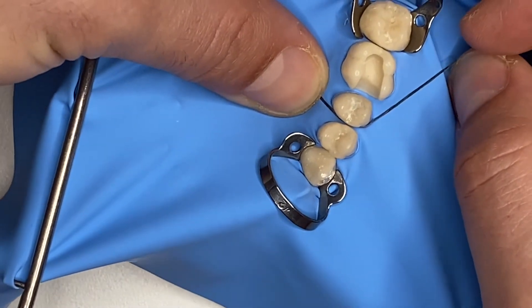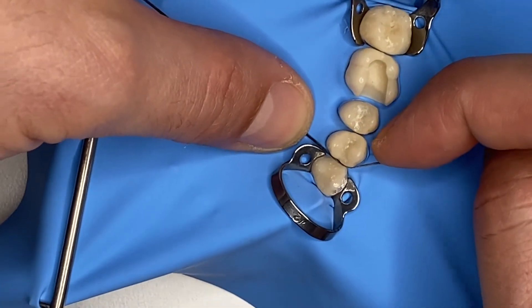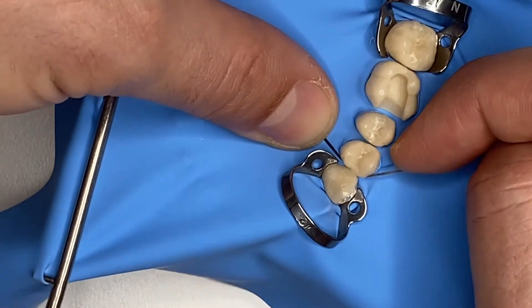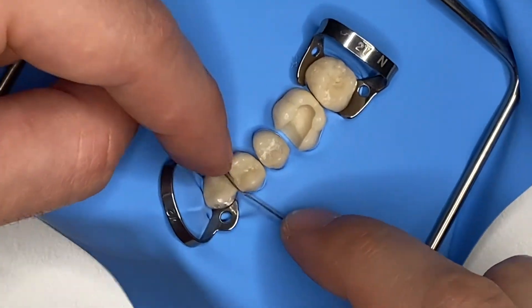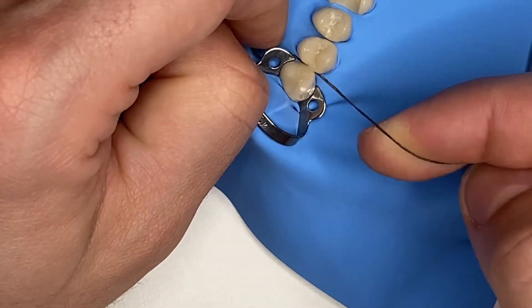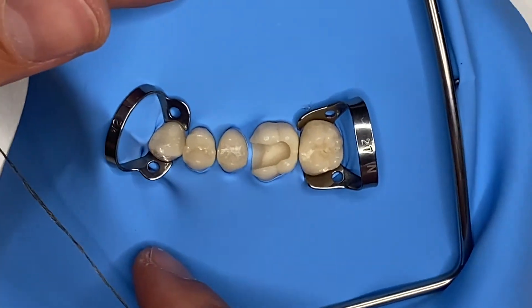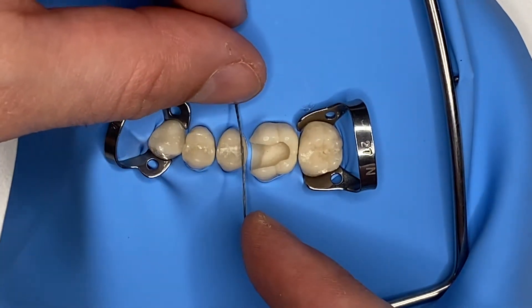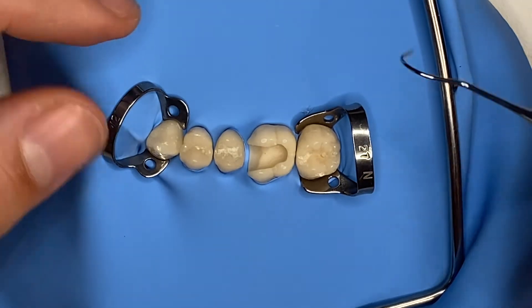I do this in every space: I go on the mesial wall, I follow the mesial wall, then I go back out and follow the distal wall of the mesial tooth. This helps me invaginate the rubber dam in these spaces. If I'm not able to completely invaginate the rubber dam, no problem.